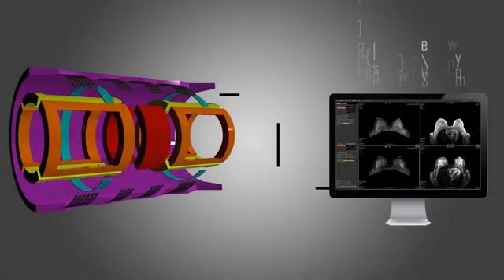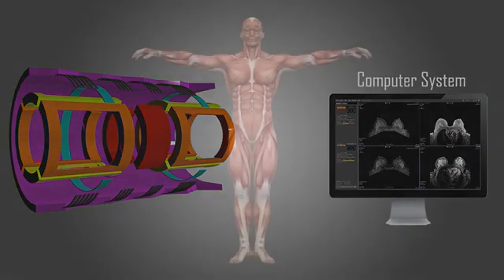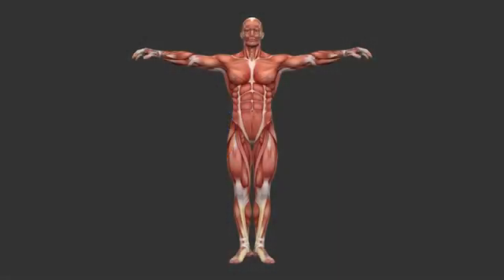All the controls of the scanner are handled by a computer. The human body is mostly water. The water in our body is found in 2 main locations, in our cells and outside our cells. The atomic structure of water includes 2 hydrogen atoms and 1 oxygen atom. And it is the hydrogen nuclei, or protons, that are important in the MRI scanner.